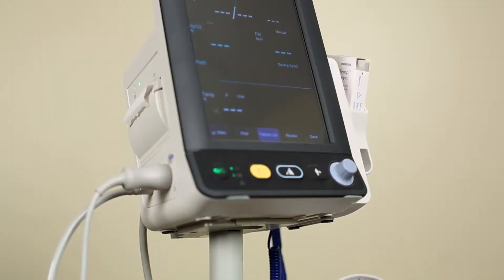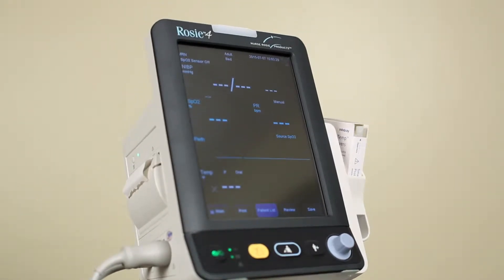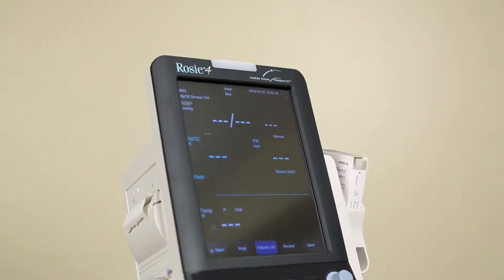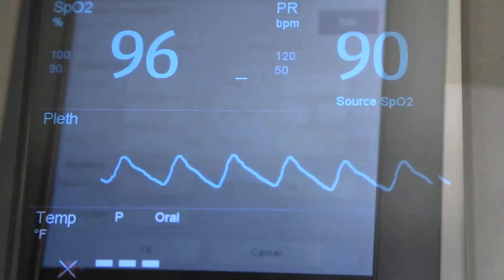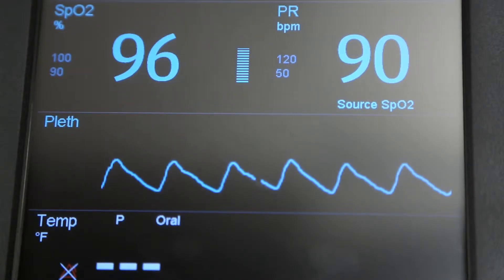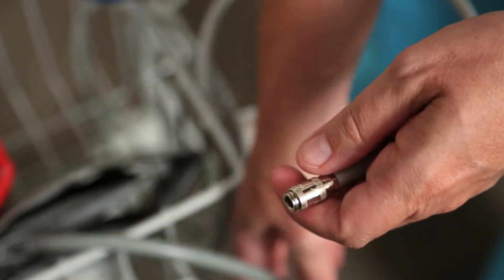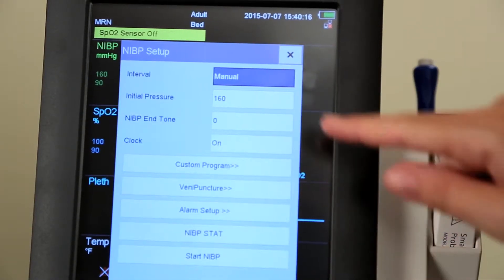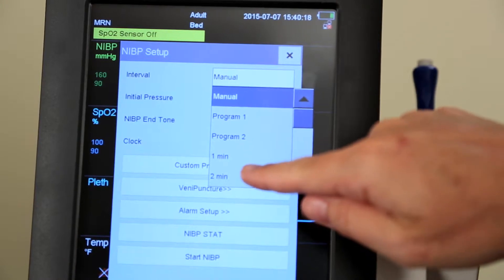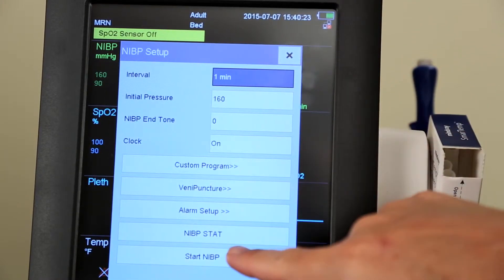The new Rosie 4 offers an 8.4-inch high resolution touch screen that displays clear images. Stores up to 5,000 easily retrievable measurements. Plethysmogram waveform. Smart cuff inflation and deflation with quick connect for fast cuff size changes. Manual, automatic, and customizable NIBP measurement modes offer flexibility for various clinical applications.